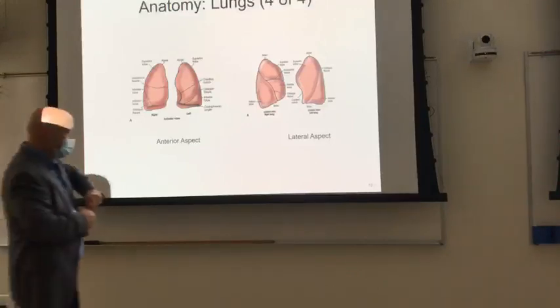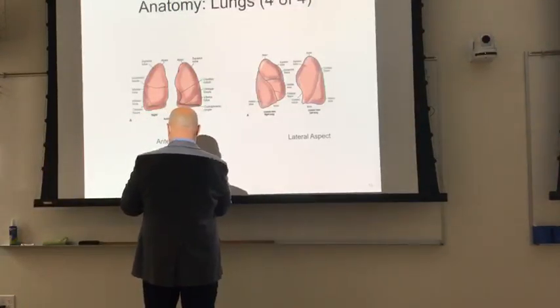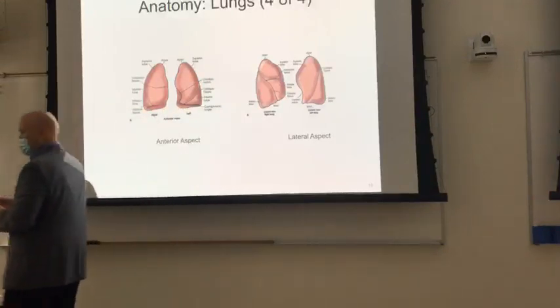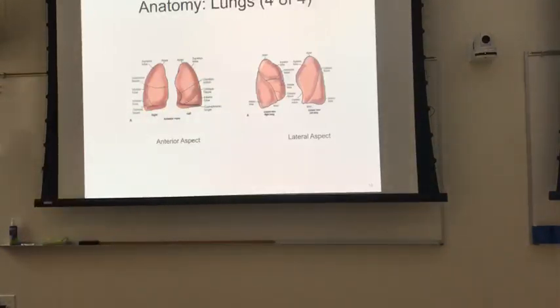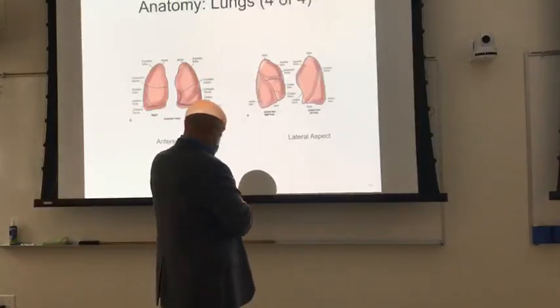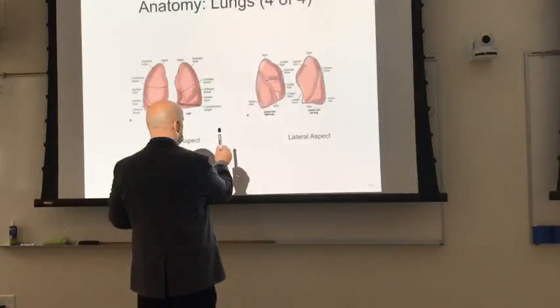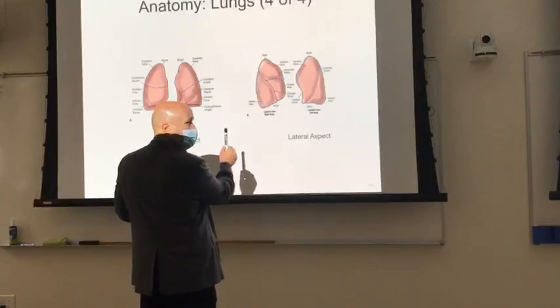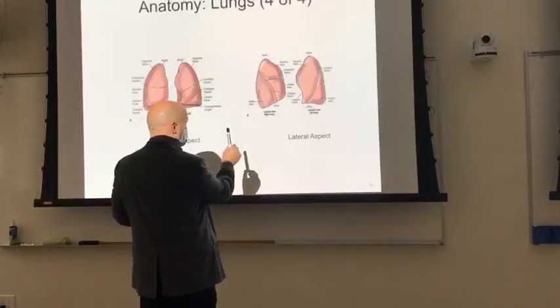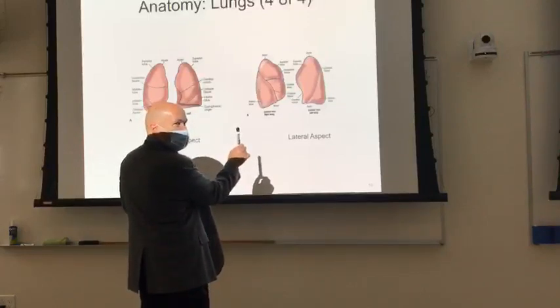Another example would be if we had a fracture, a subtle fracture in this case. Looking at the shadow of this pin, does it look like there's anything funny going on? No. Just the shadow of the pin? The cap looks like it's on there just about right? But if I turn it sideways, what do you see? It's at an angle. It's at an angle, right?